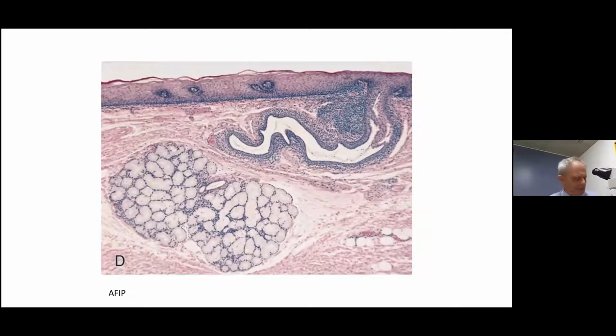Then there's the normal histology of the esophagus, and here, I hope you can see the slide, at least the pointer. This is actually a slide from the Armed Forces Institute of Pathology, and a very nicely orientated section. You can see the non-keratinizing squamous epithelium at the top, this very narrow basal layer of basaloid epithelial cells.